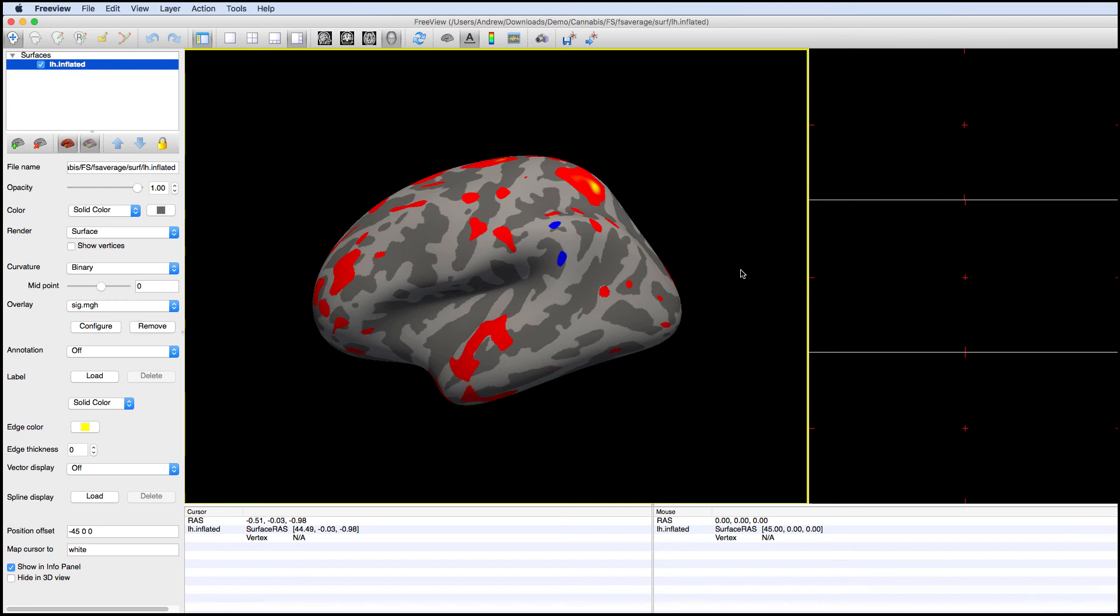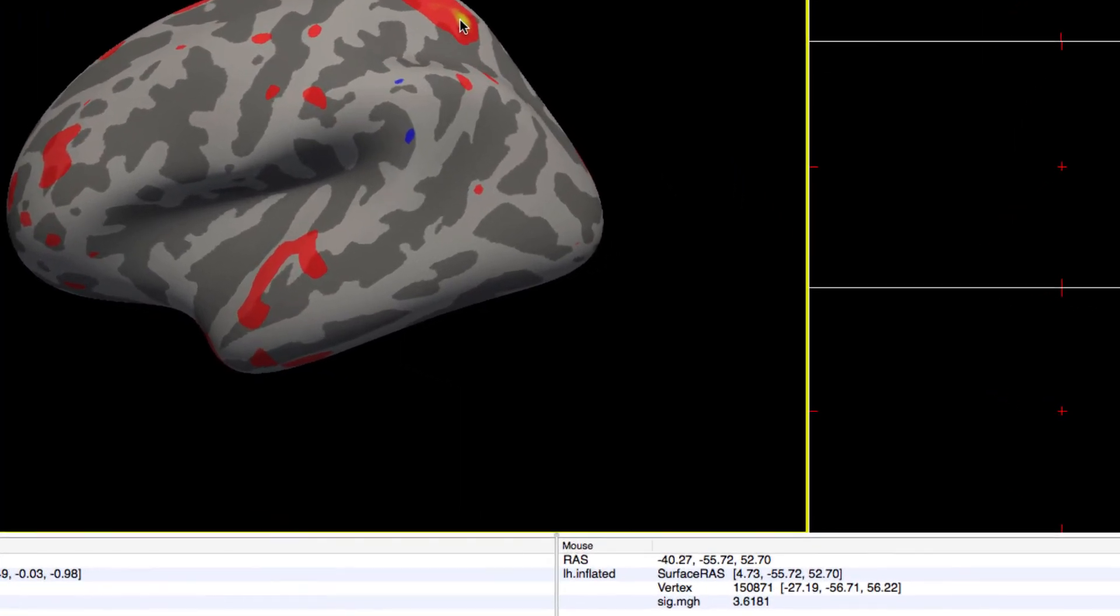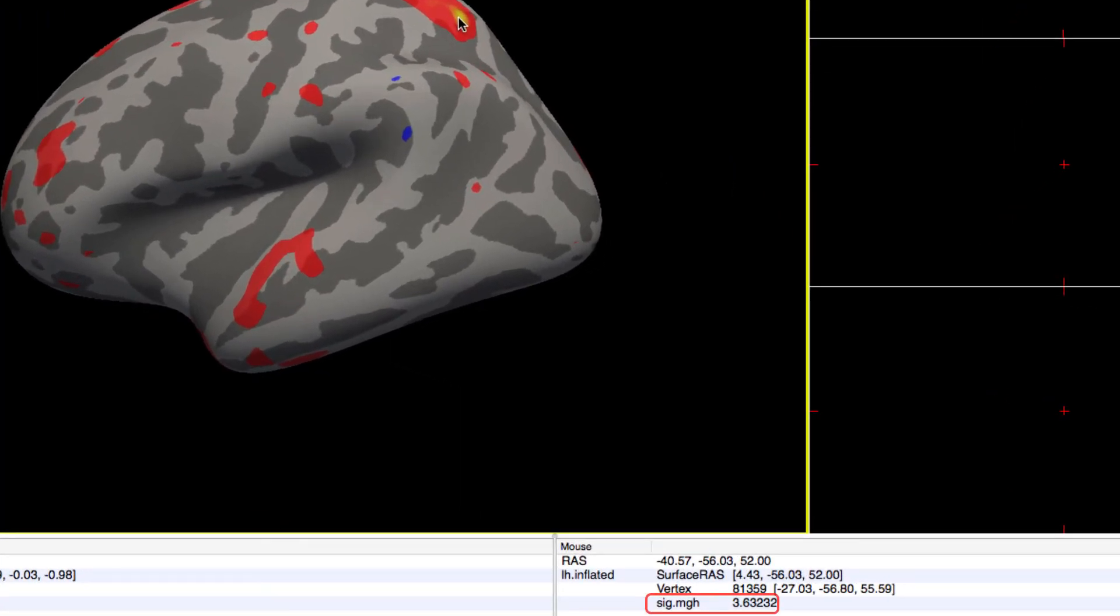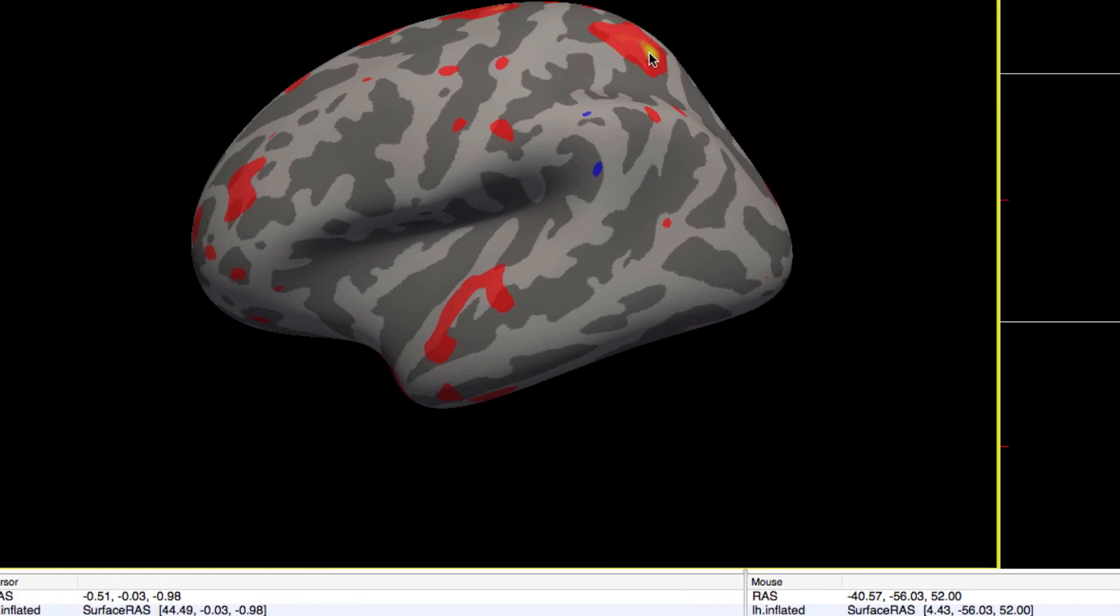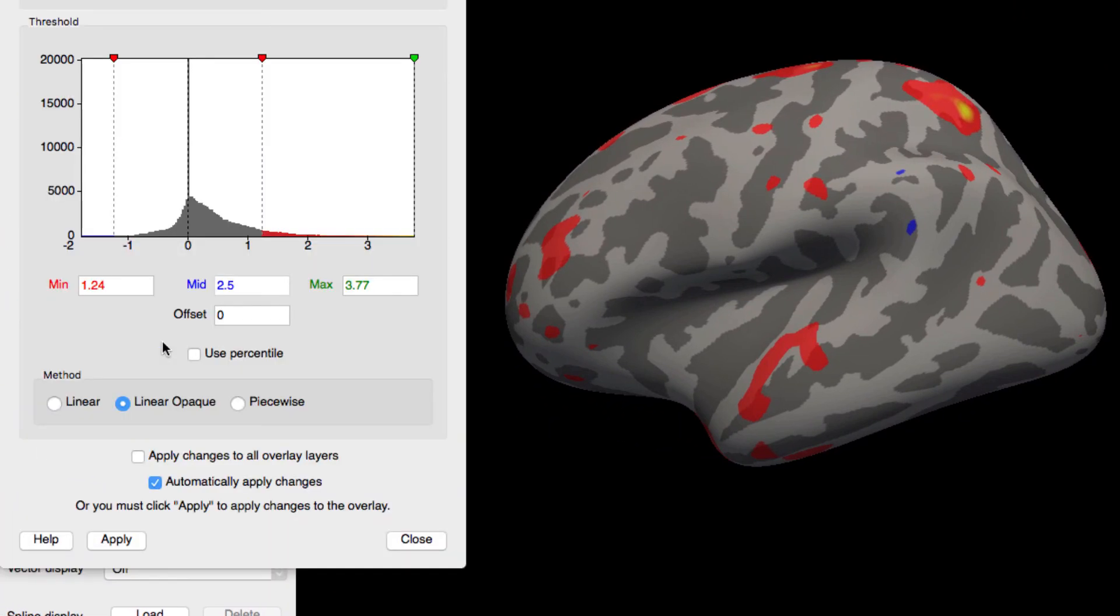Make sure to load the hemisphere that the directory is based on. In this case, the left hemisphere. Also be aware that FreeSurfer uses negative log 10 notation. In other words, a value of 3 corresponds to a p-value of 0.001. Click on Configure to change the threshold of what is displayed on the brain.